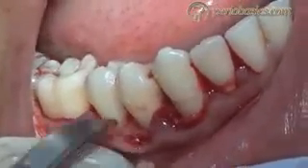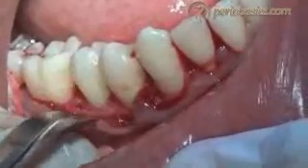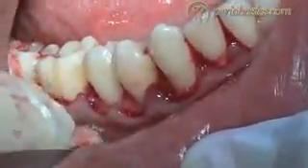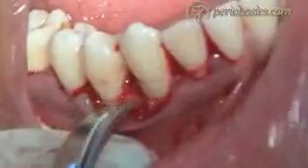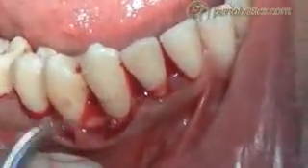And the important step in this flap procedure is the removal of the granulation tissue and tissue tags from the flap. So you will see that from the inner surface of the flap we are removing the granulation tissue and all the tissue tags.